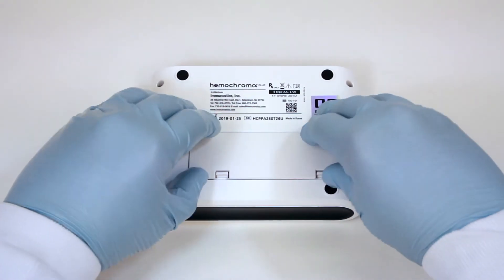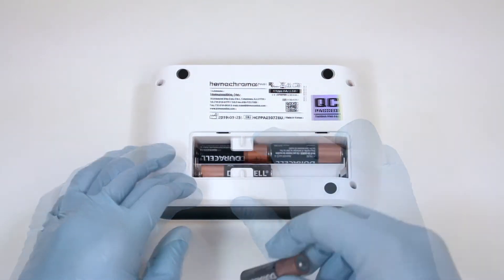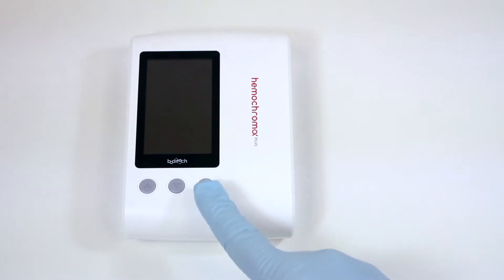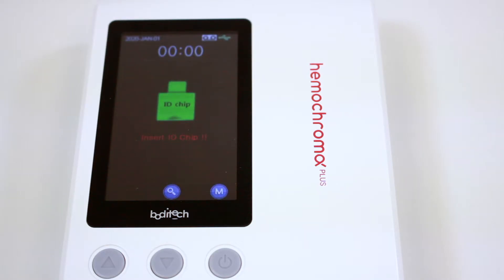Setting up the Hemochroma Plus: Remove the battery cover provided at the bottom and insert the four type AA batteries. Press the Power On-Off button. The Hemochroma Plus Analyzer is ready for operation when the Display Insert ID chip appears on the screen.